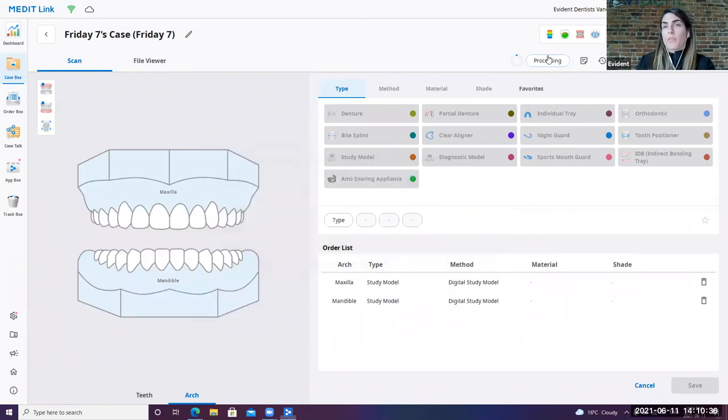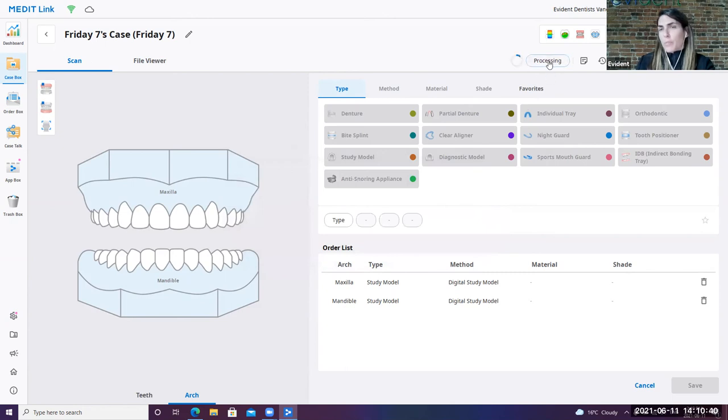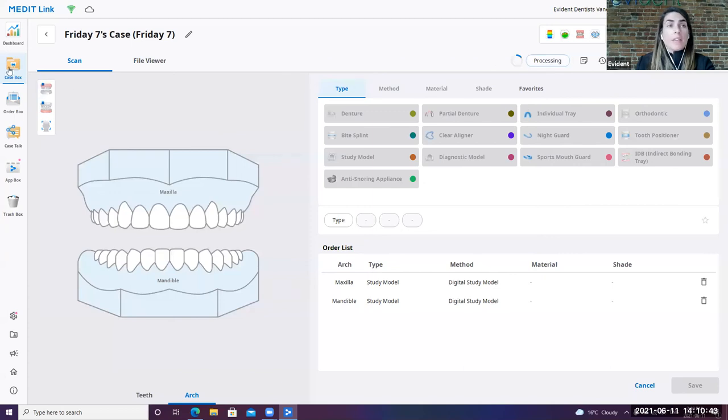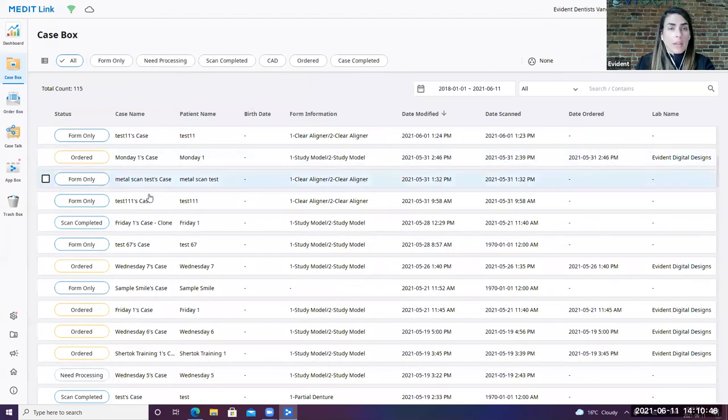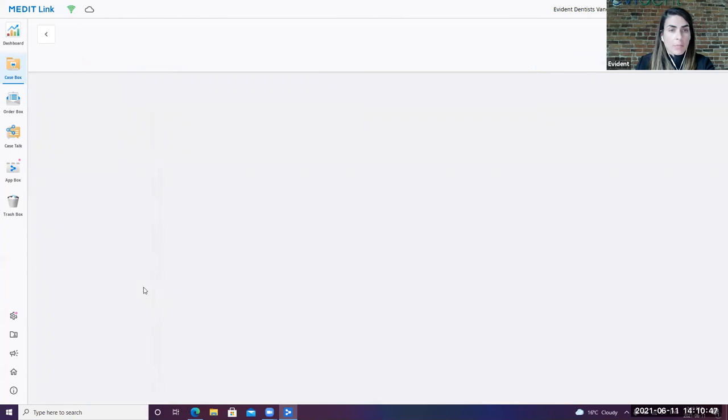So you'll see here that it went from a form only to processing. So this takes about 45 seconds to a minute, depending on how large the file is. In the meantime, I'm just going to quickly show you a small sample.